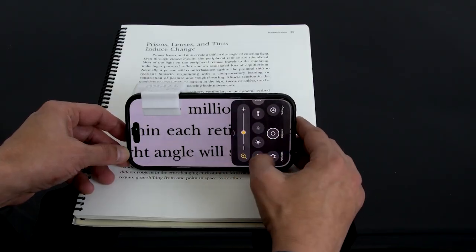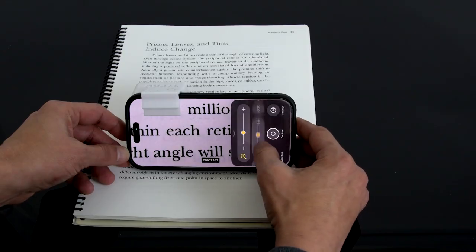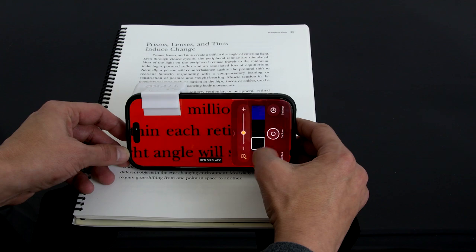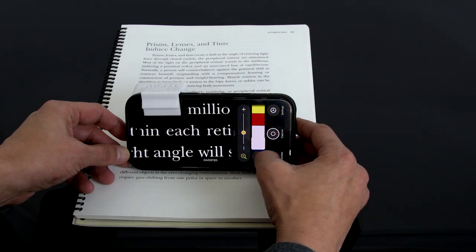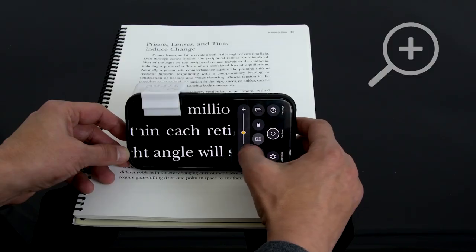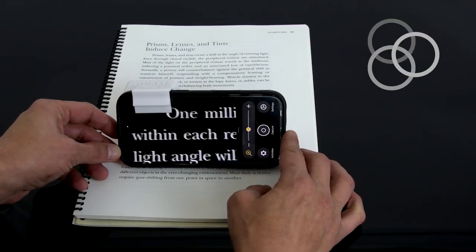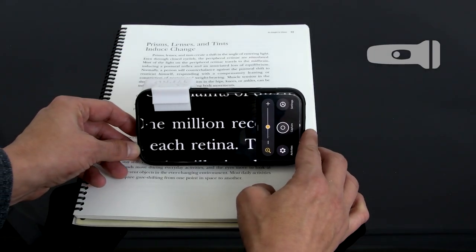The Magnifier app has a customizable menu of features. If you don't see an option you need, slide the menu open to view the full options. Any options you don't need can be hidden in the settings. The following features work best: zoom, contrast, brightness, filters, and flashlight.